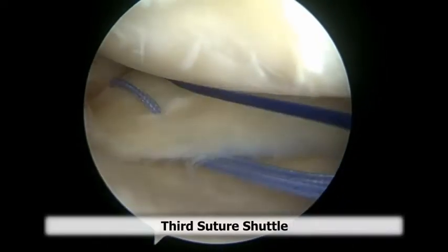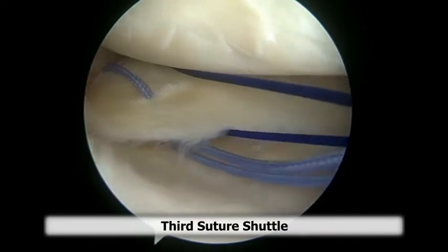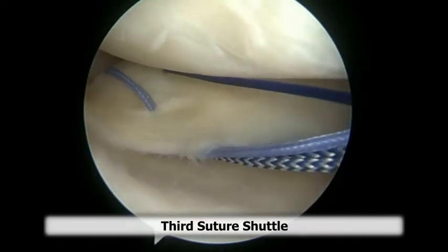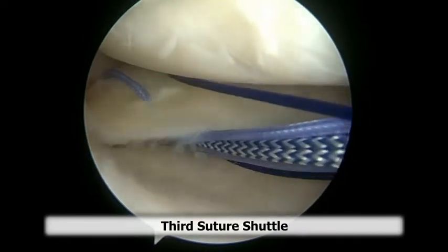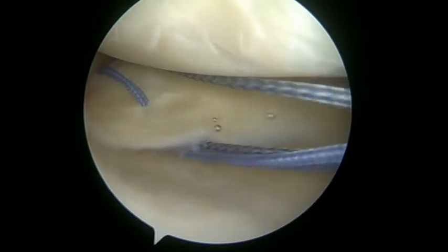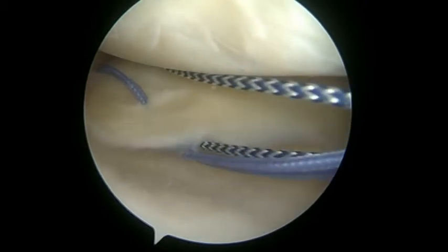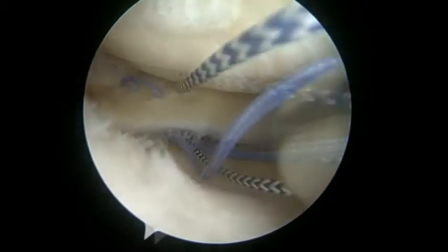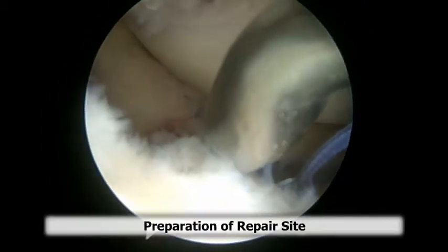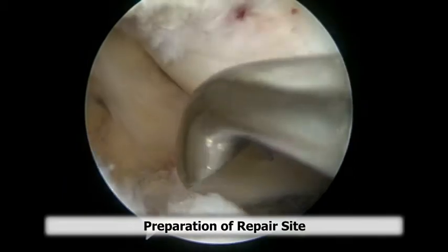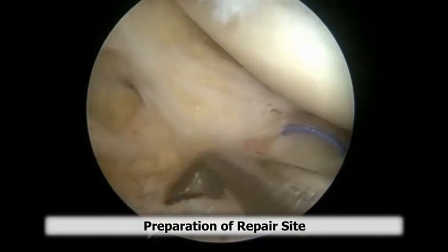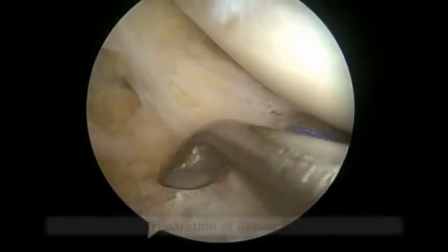A simple stitch will be placed medial to the horizontal mattress in similar fashion using a PDS to shuttle. Next, we use a curette to prepare the repair site and debride any soft tissue.